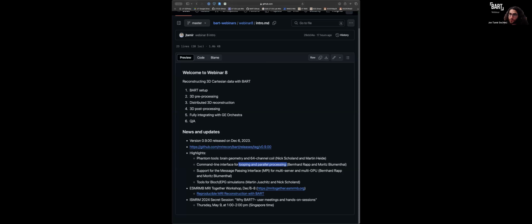That webinar went through the basics of BART, how to use it with the phantom tool to do reconstructions, and then reconstructing 2D data from a Siemens MRI scanner with a lot of the same pre-processing steps. So that's good if you're new to BART and want to see how to use the tools from first principles.